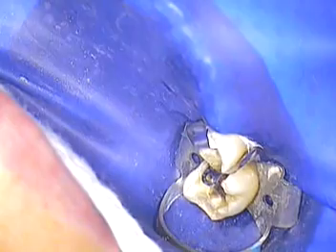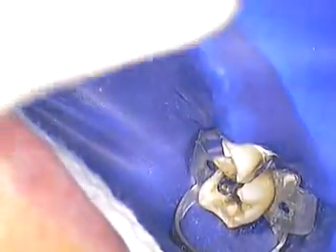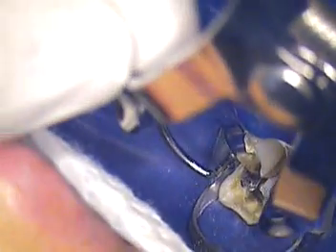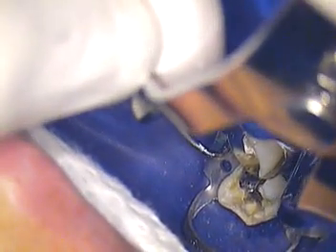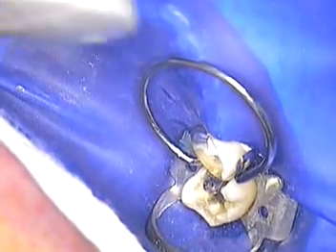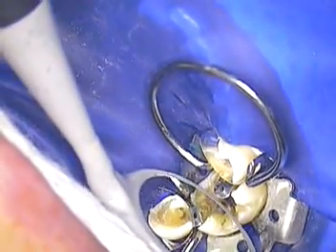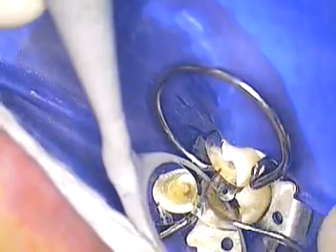We'll do the cusp first and build it up to where I like it to look. With that we put the clamp next — right there, nice pass. The next step is checking it with a large explorer. Open up a little wider, we're gonna put this clamp in place — let's sneak that in there. There's our Composite Tight, and we check it with the explorer as previously discussed.